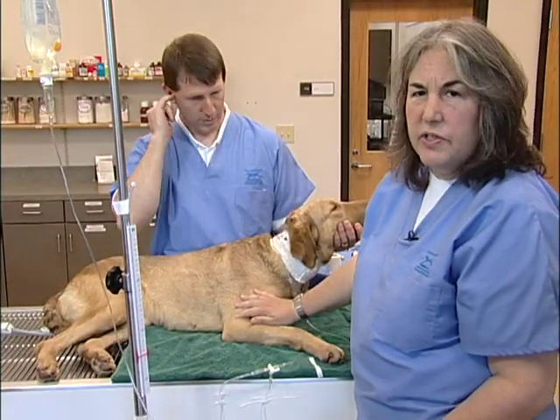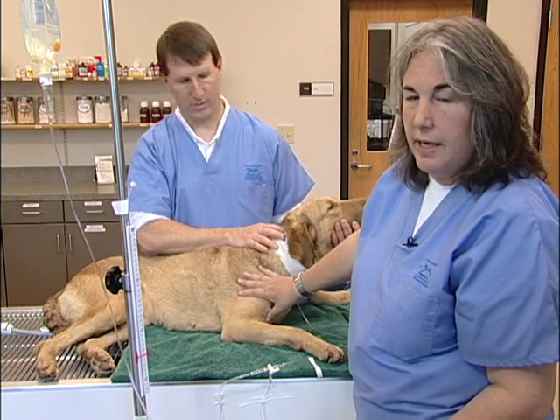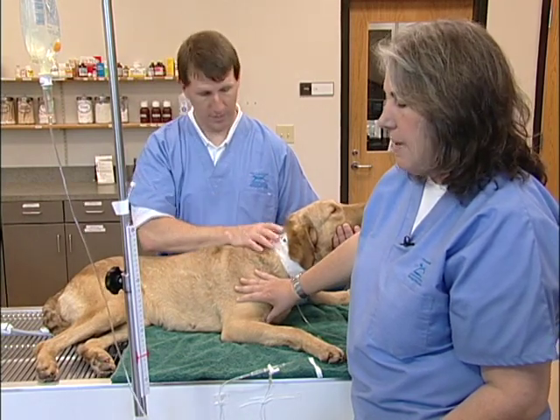Once the manometer has been set — note we've set it on this dog in sternal recumbency — it'll be very important to take all the subsequent readings on this dog in the same exact position so that the zero mark remains consistent.